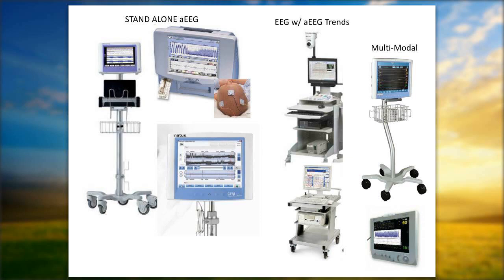The next kind of obvious choice would be to have an EEG device that's being used by your neurology or neurophysiology department. And so now we can get aEEG trends added on. It's just a software algorithm that can be added to a standalone EEG device. The advantage of this is you have one piece of equipment that can serve several functions. And typically these devices have video, which is really helpful when you're looking at the tracings and trying to look at artifacts. And the other piece of this is that because the EEG department has purchased it, it probably already has all of the hardware that you might need for connecting into your server, for remote viewing, and some of those other pieces of data management that become very time consuming.